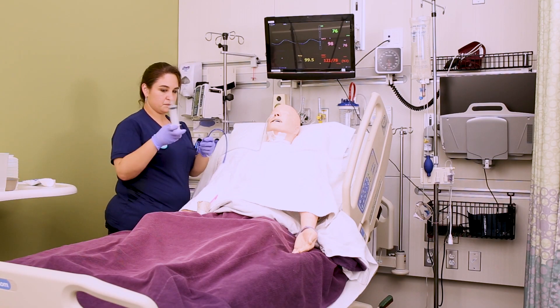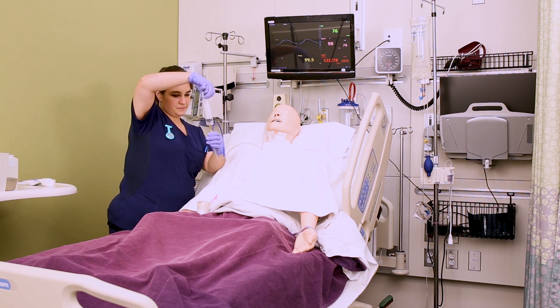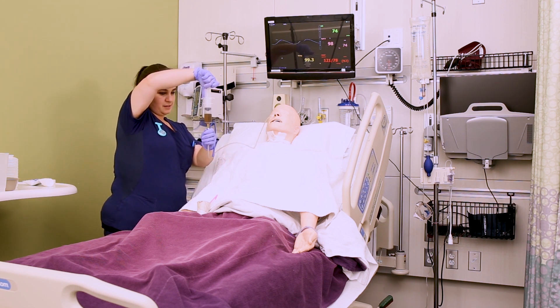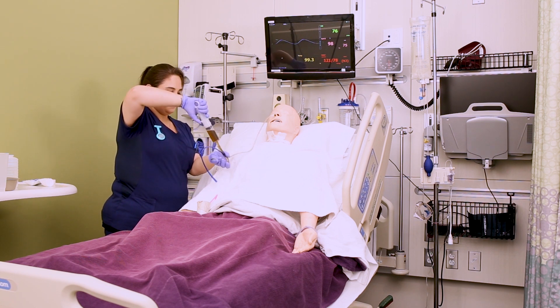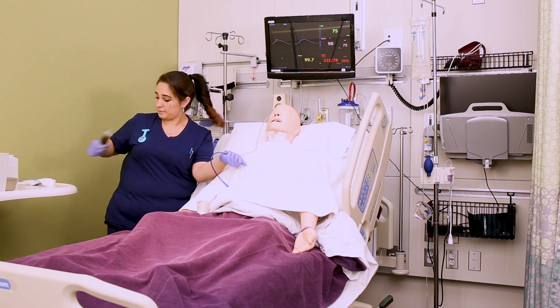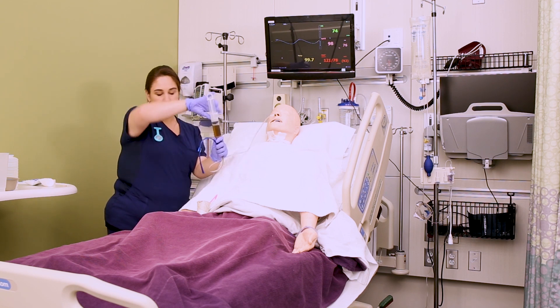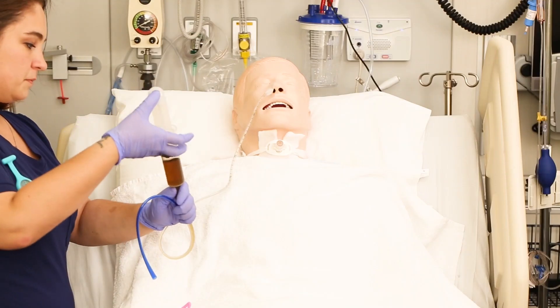To check placement, use the 60 mL syringe to aspirate the gastric contents. They should be greenish or brownish and may have some undigested food — that's normal. You just need a little bit. Take that gastric aspirate, clamp your tube, disconnect your syringe, and check the pH. You want to see it less than four, showing that it is in stomach acid, so that you can confirm placement.